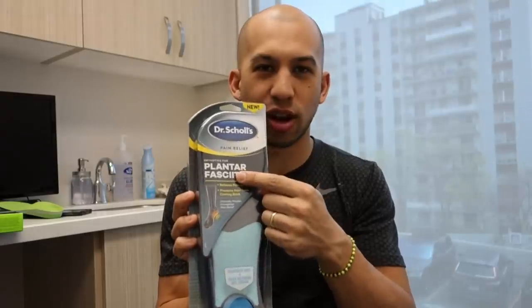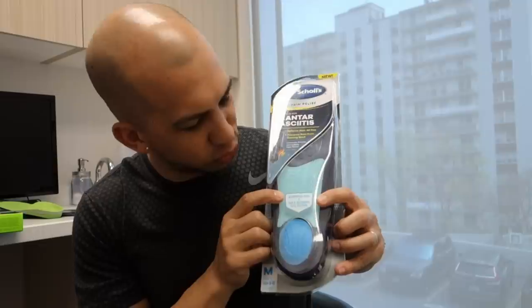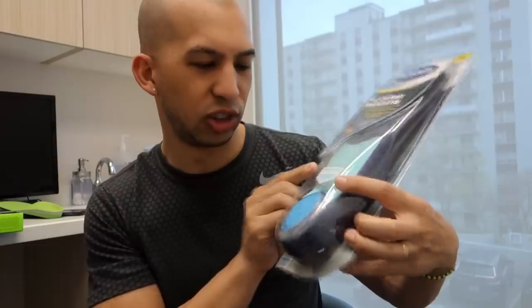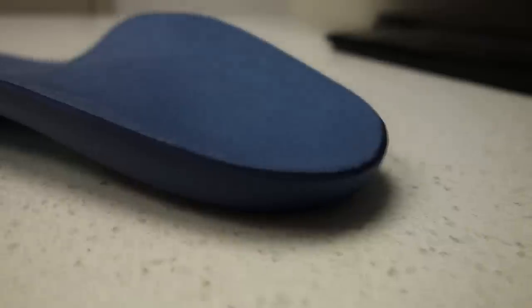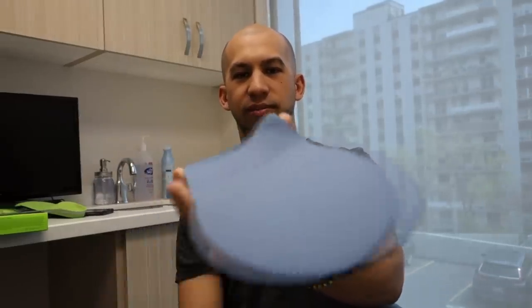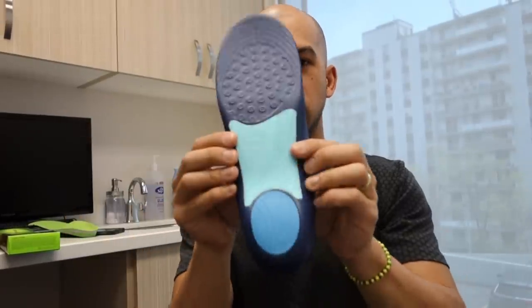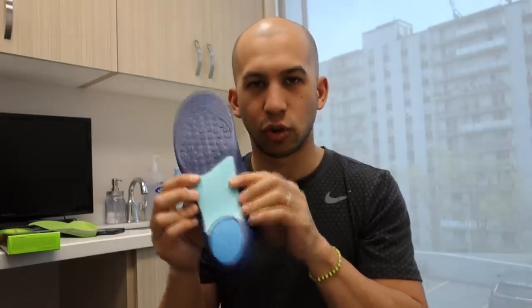Next we have a Dr. Scholl's Pain Relief Orthotic — it actually says orthotic for plantar fasciitis. It claims to prevent pain all day and prevent pain from coming back, with a reinforced arch and shock-absorbing heel cushion. This one is much different from the previous one. There's a lot more material and a lot more shape to this device. From the side view we can see it comes up with more arch height, more of a heel cup, and in the middle there's a firmer plastic acting as the arch support.